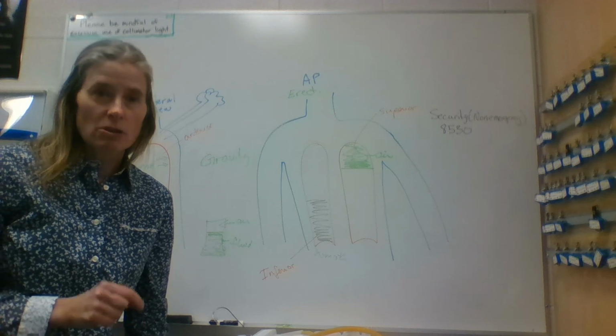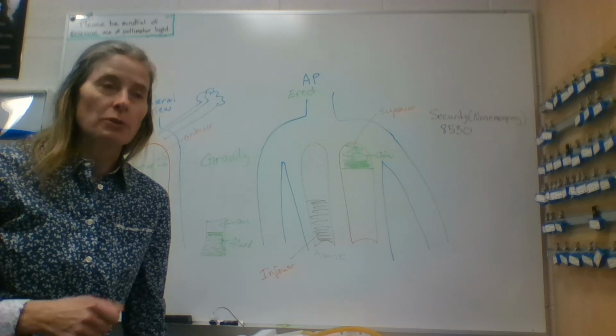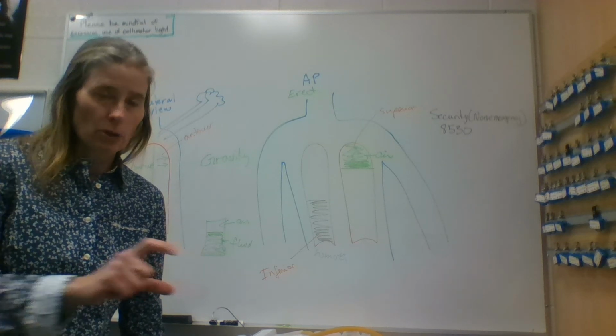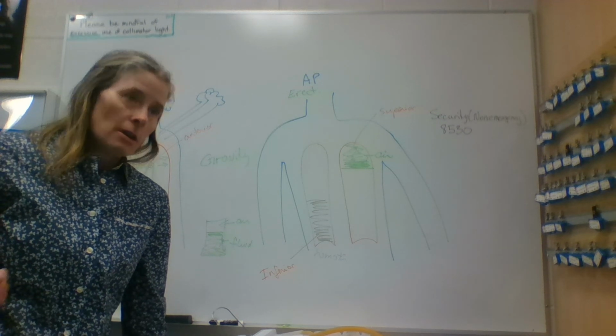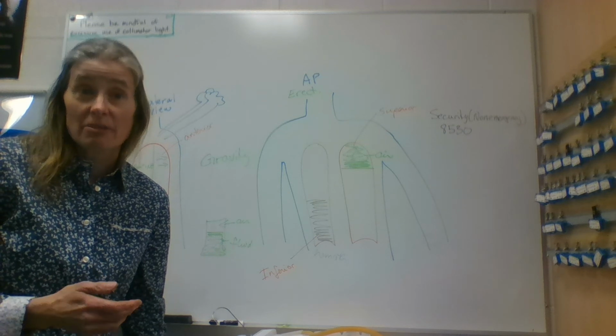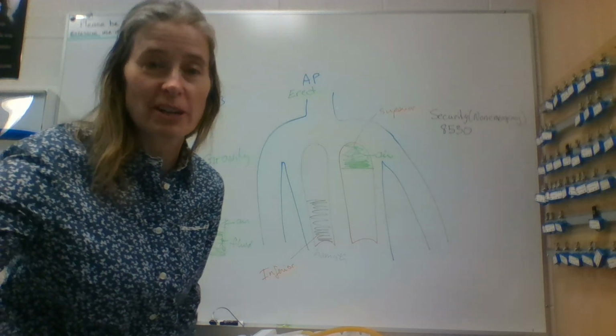But please, as a technologist, particularly during the transfer of these patients or as you're moving them about, make sure you are well aware and conscientious as to where those are at all times. It's dark in our rooms. It's easy to step on them or trip. So just keep that in mind.